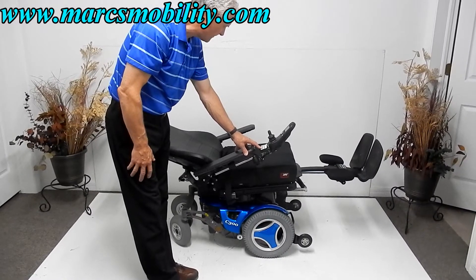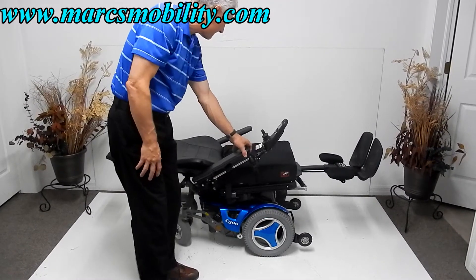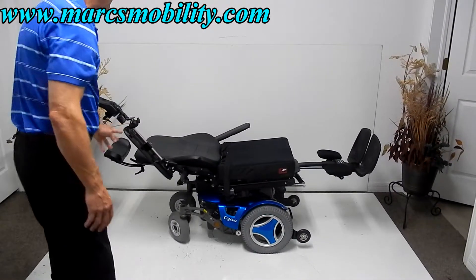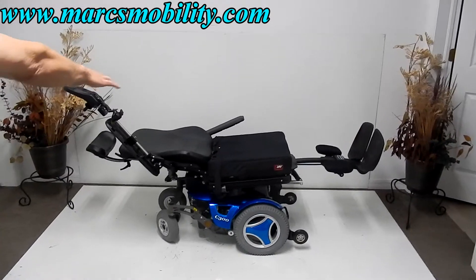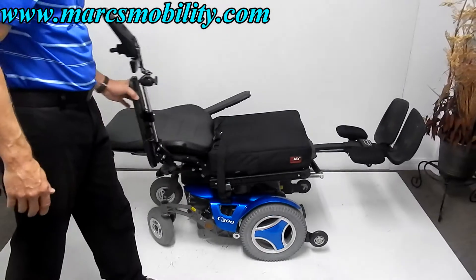The nice thing about this Permobil — if you look at the seat and where you're sitting relative to your legs, you're pretty much completely flat on this chair, which is very, very nice.